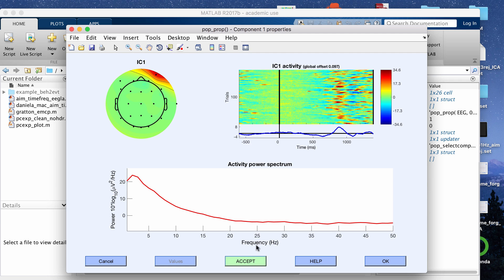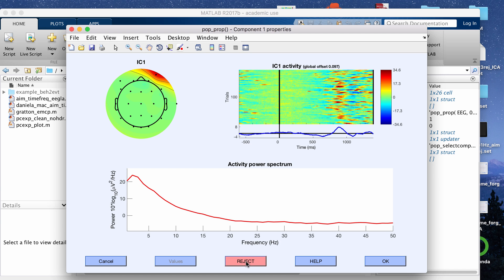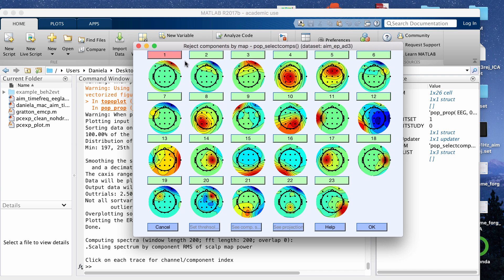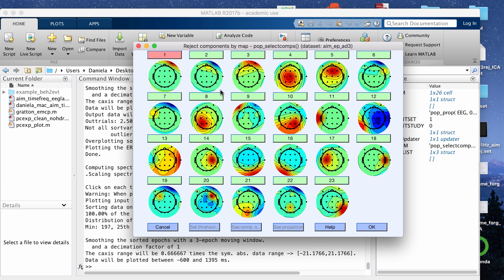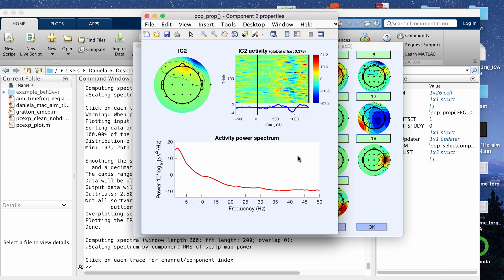You can mark any of these independent components that you look at for rejection by clicking the accept button. If you click it, it will change accept to reject or vice versa. Once you click OK, you're not actually removing the independent component yet. You're just marking it for rejection. I'm going to mark the first three for rejection.